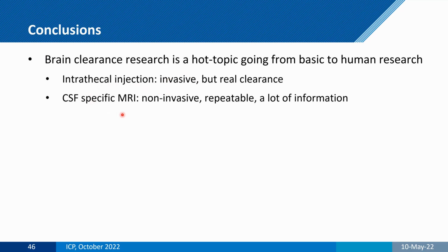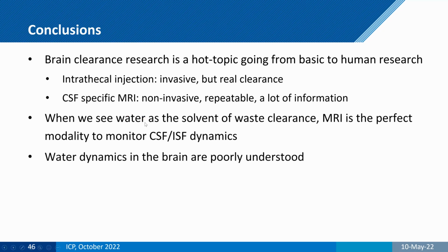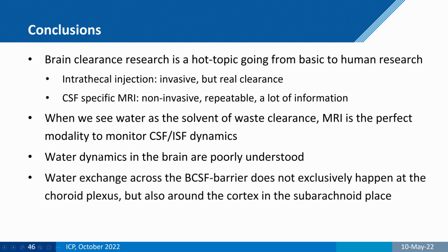With MRI, we're getting a lot more possibilities, and I think also at the next ISMRM we will see many more techniques being proposed. Water is still an excellent candidate to monitor it. I think we still don't really understand how water is exchanging between different compartments. For example, we have shown that the water exchange does not exclusively happen at the choroid plexus, but also around the cortex.